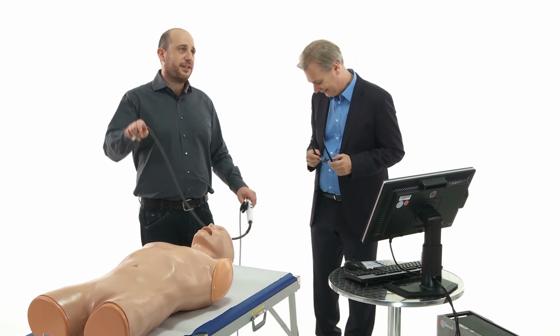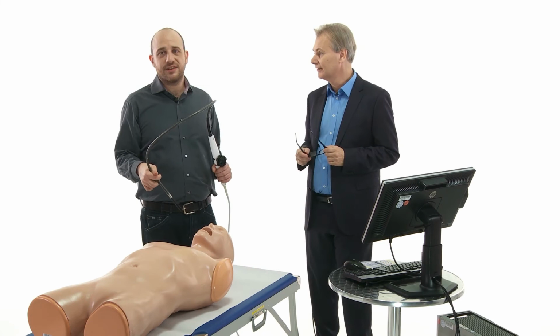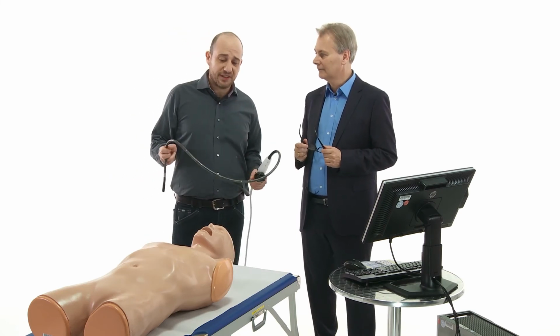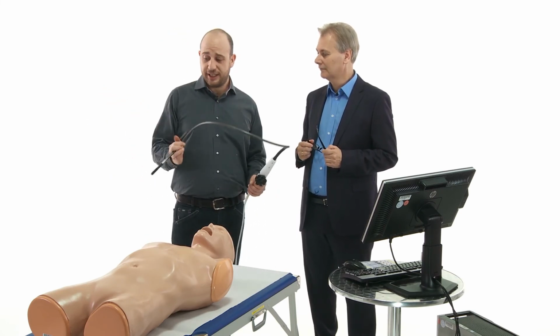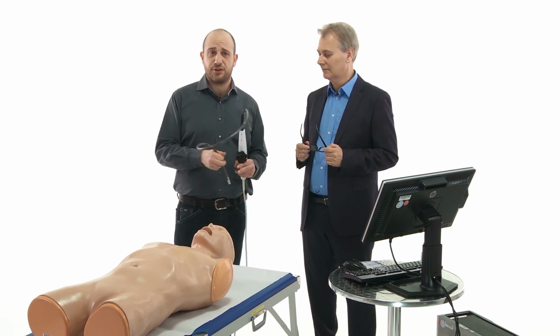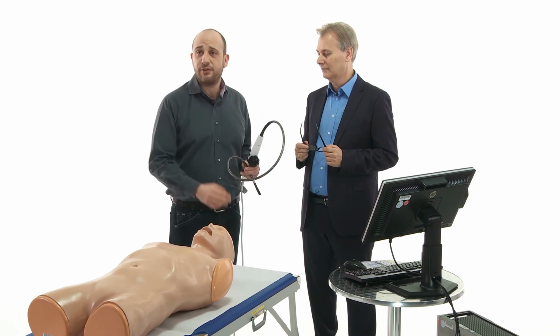Bruno, can you just shortly tell us what the differences are? Yeah, there are differences of position sometimes, differences of place, and differences of patients. Because our patients are very sedated, sometimes they have some muscular relaxation, very often they have opioids. That means they are very well sedated and they don't feel anything. In my experience, because of my training in echocardiography, I was used to introducing the probe from this position, exactly behind the head of the patient.